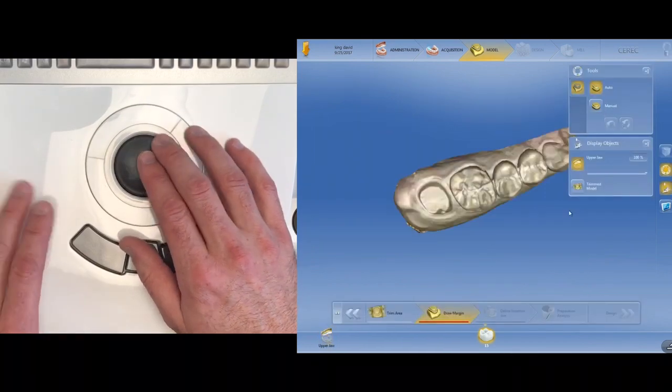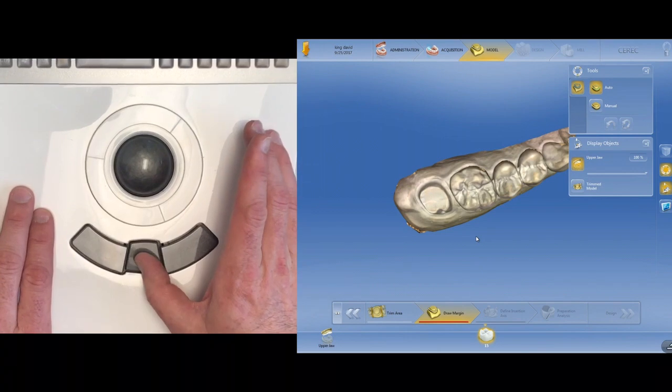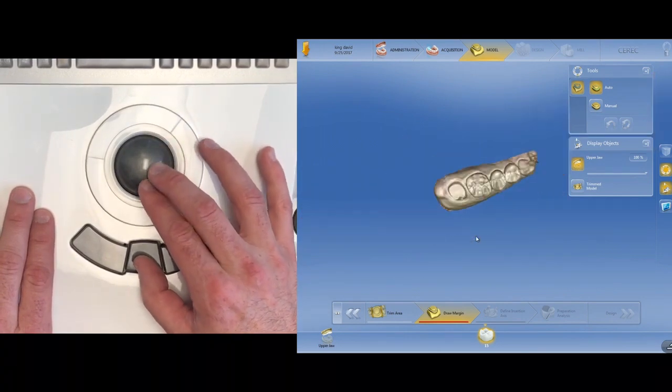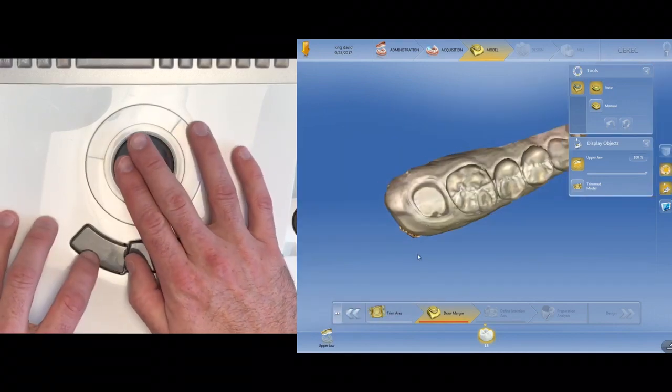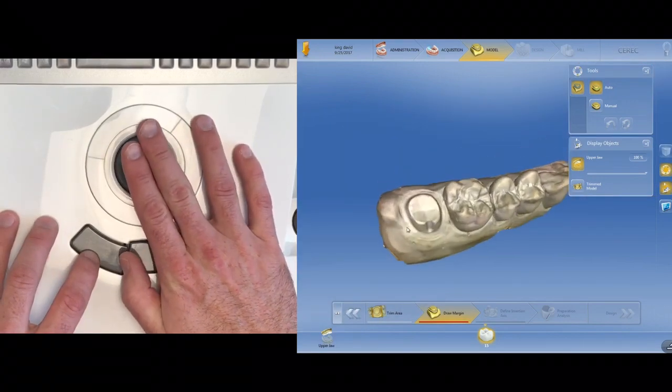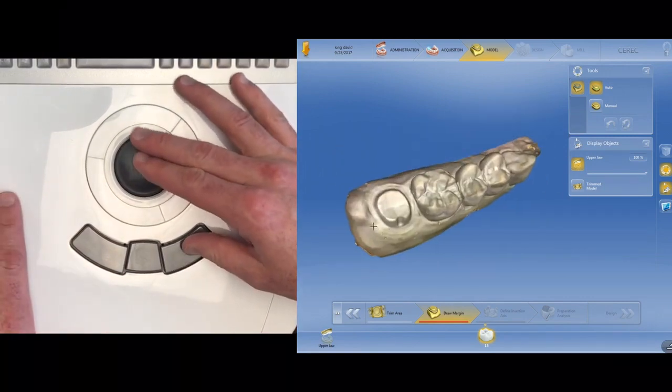And now this is our margin step. So now all of the tools are active. So let's look at that zoom. Press and hold the middle button and roll up and down, up and down. All right. And you can rotate. And you can pan with that right button.